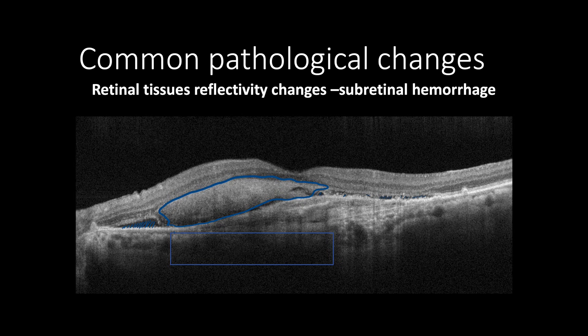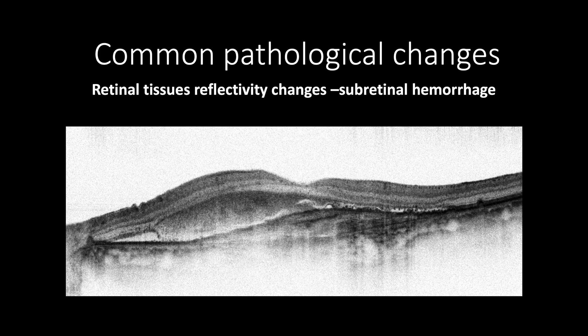This cross-section shows fibrovascular pigment epithelial detachment which has more heterogeneous hyperreflectivity. This is more appreciated using negative black and white mode, as the subretinal hemorrhage appears as a more homogeneous black color with smooth regular borders than the contents of the fibrovascular pigment epithelial detachment, which appears as heterogeneous black color due to fibrovascular components.